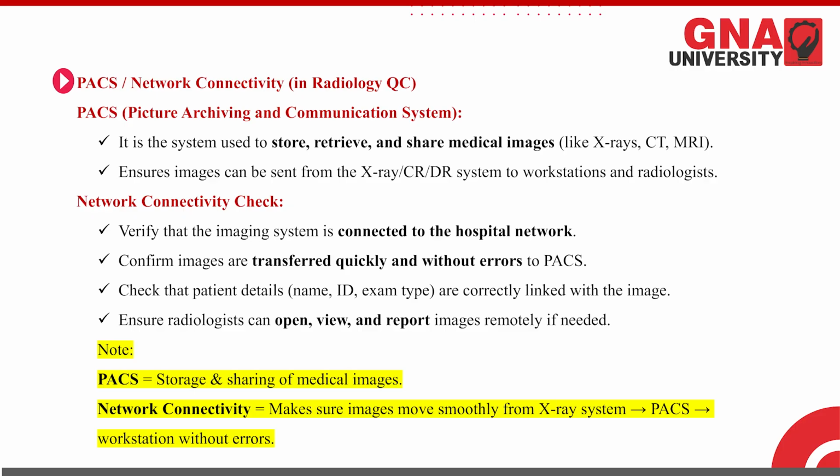That means everything should be linked with the image properly: that this is the image of this patient, this patient has this patient ID, and the examination type is the chest, the abdomen, or any other. So it should be linked with the same patient, and we have to ensure that radiologists can open this image, view it, and report it remotely if needed.